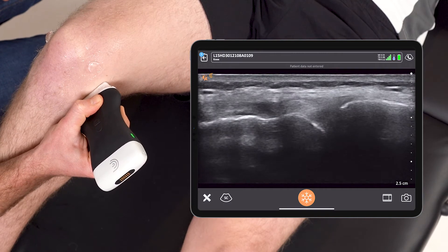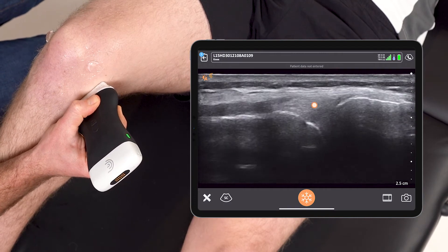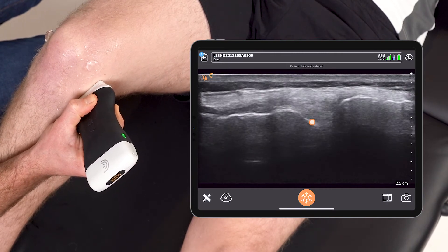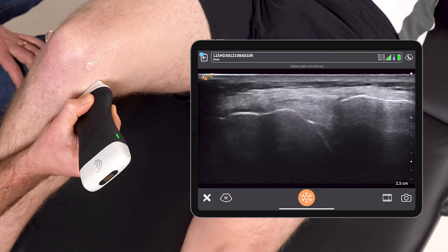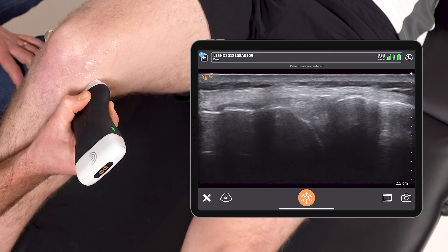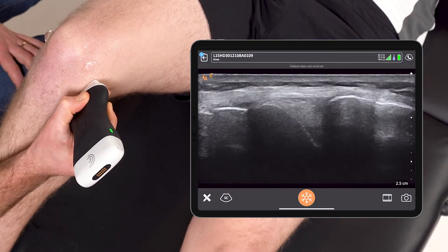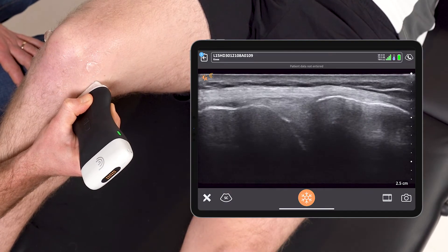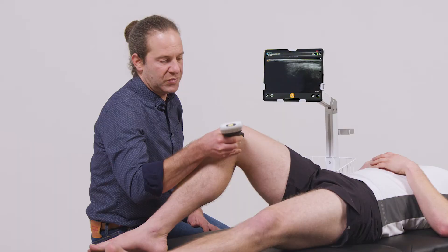A scan through identifies the medial meniscus, where I can sweep through the entire aspect here looking for obvious tears, breaks, or bulging knee effusion.